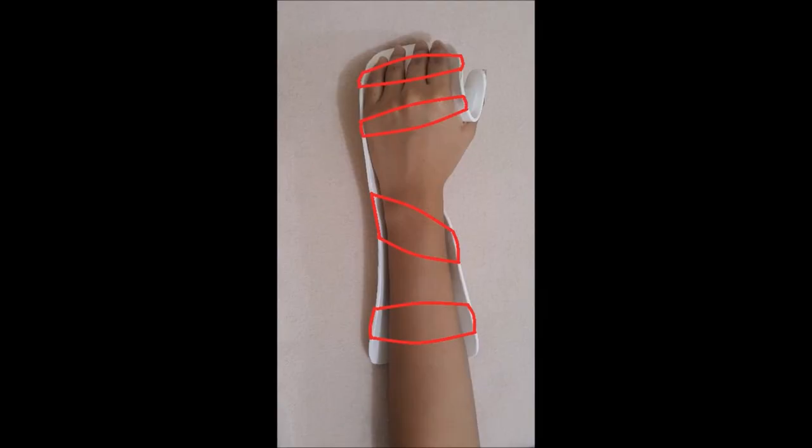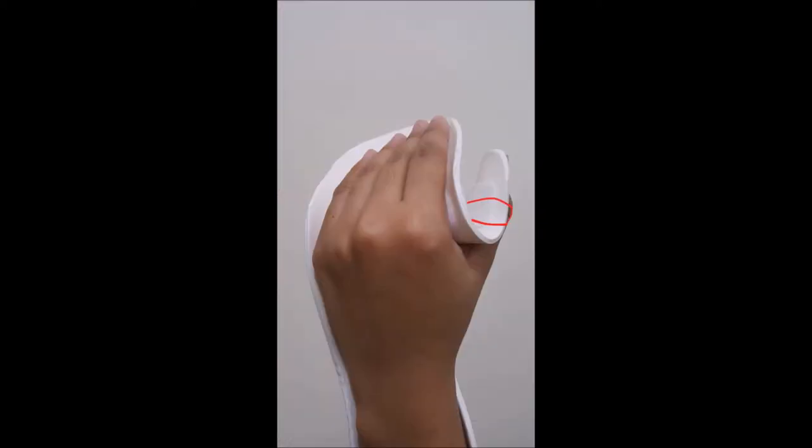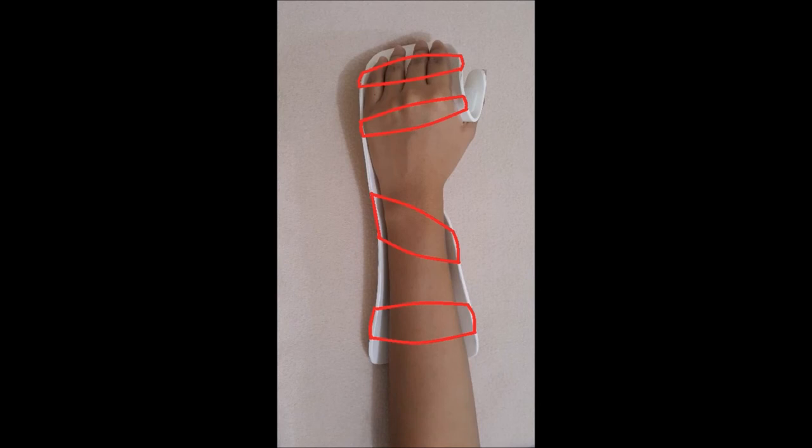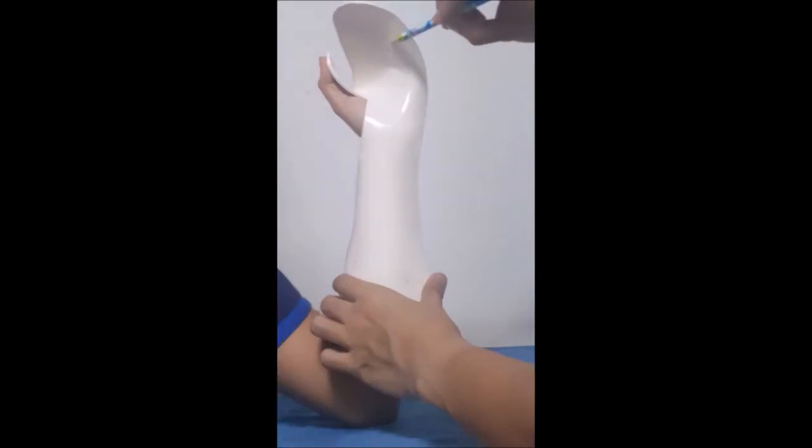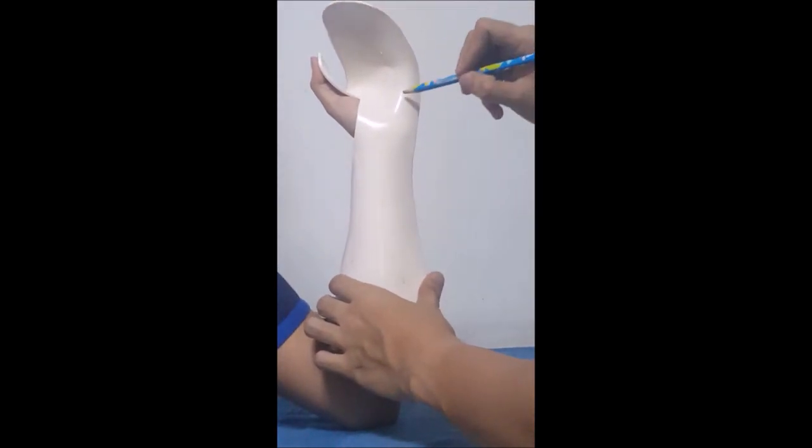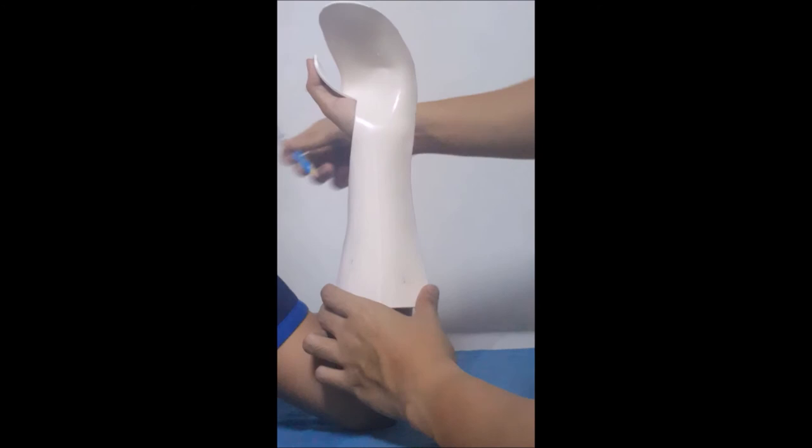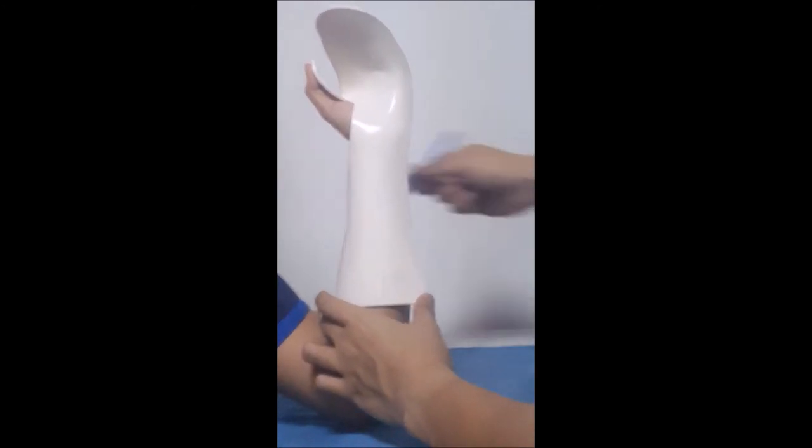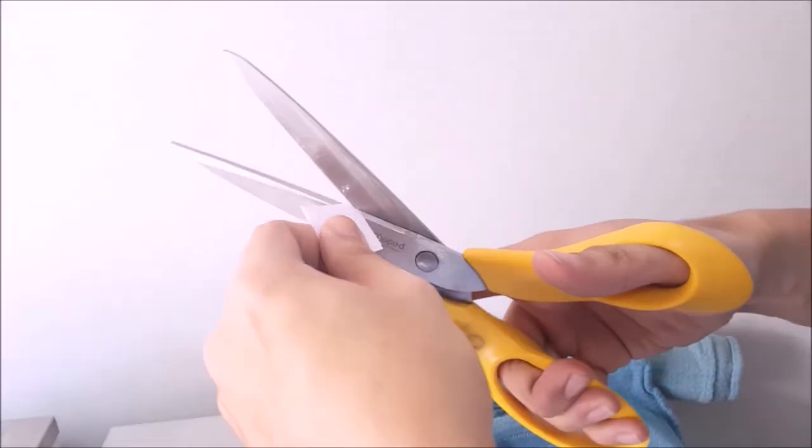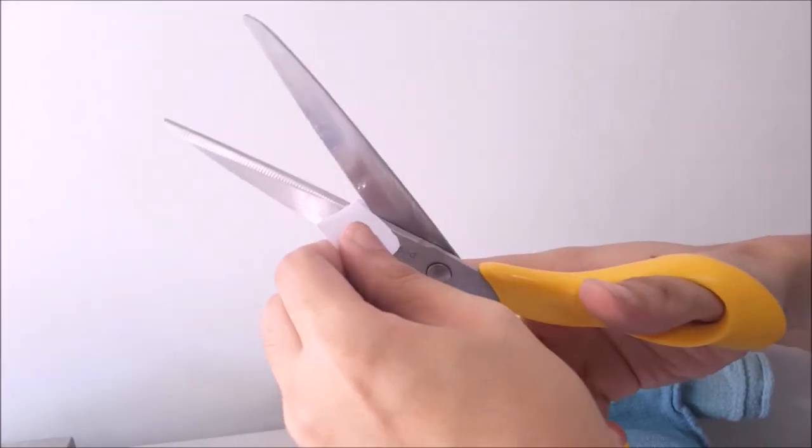Strapping: The straps should be across the PIP joint, proximal to MCP joints. For the thumb, proximal to IP joint, across the wrist, and across the proximal forearm trough. Now mark the landmarks for strapping. Make sure there are rounded corners of the straps.